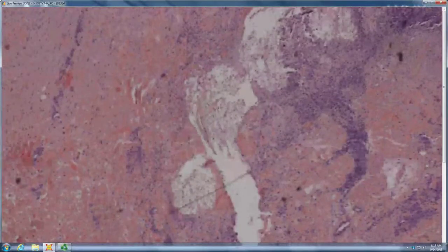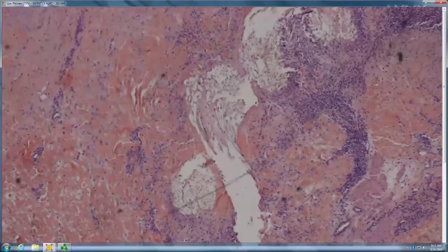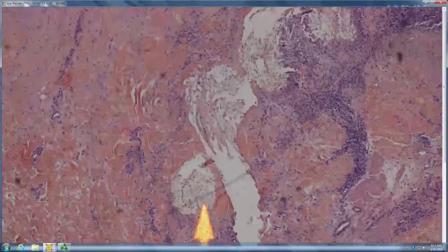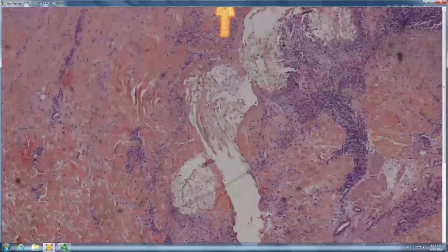There's some maybe like necrosis and tumors there, or one of those. Why is this composed of tiny little circles like that? Like suture. Like suture, and you can see the knot of suture here, right? Granuloma. So it's suture granuloma.